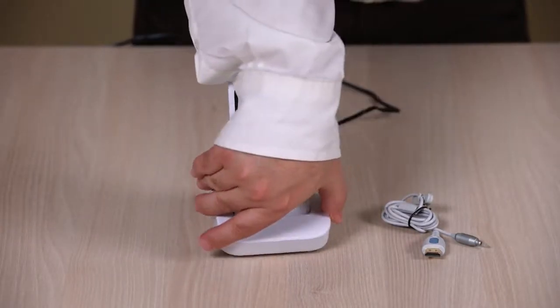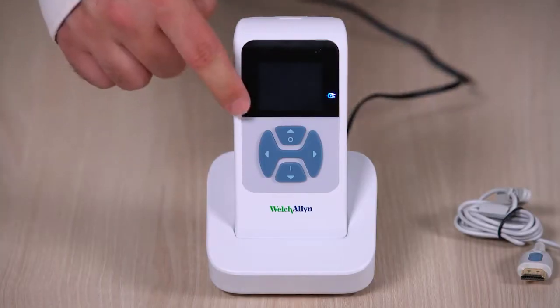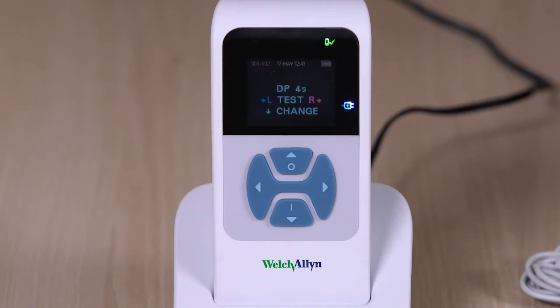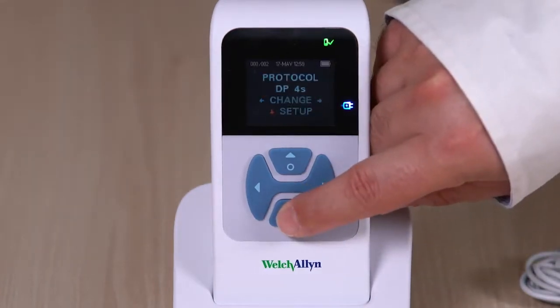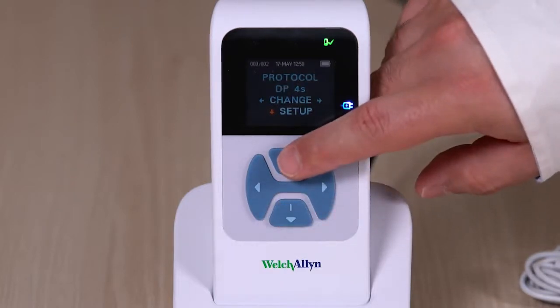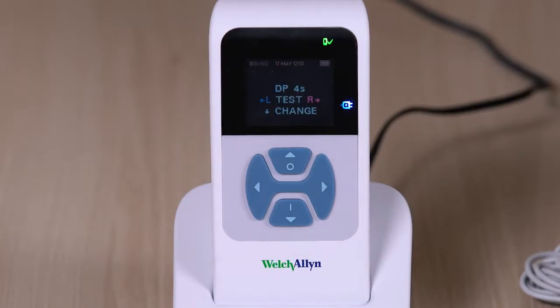It takes four hours to fully charge the battery. A full charge provides up to 15 hours of use. The OAE screener uses four buttons to control all functions. Push the button that corresponds to the highlighted arrow on the screen to move through tasks. The UP key always brings the screener back to either the previous menu or the main menu, and is used to access the print command from the main menu.